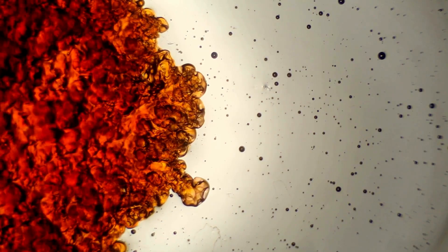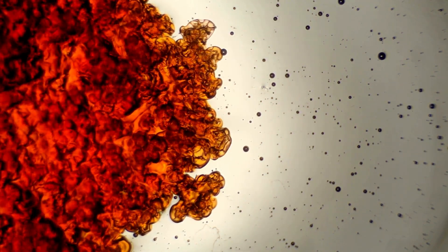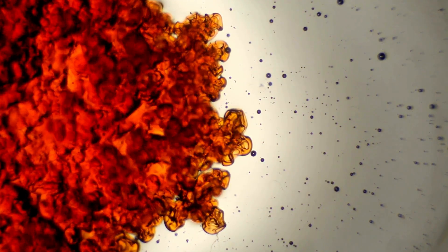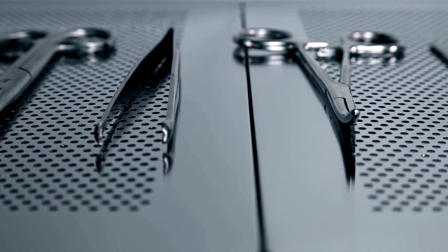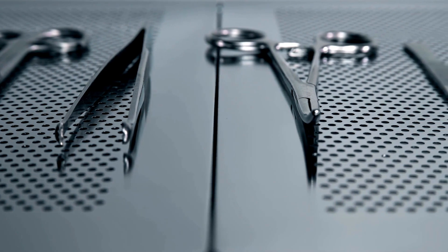What makes multi-enzyme cleaners so special? These powerful enzymes work tirelessly to break down the toughest bio-burden, leaving instruments pristine and ready for the next surgery. Multi-enzyme cleaners significantly reduce the microbial load, adding an extra layer of protection for patients and doctors alike.